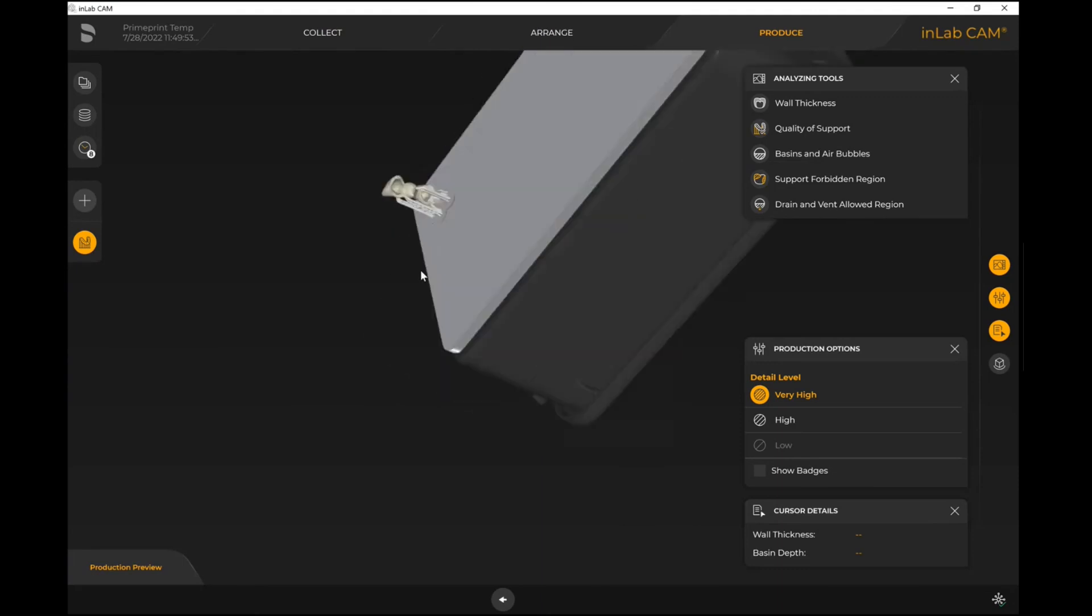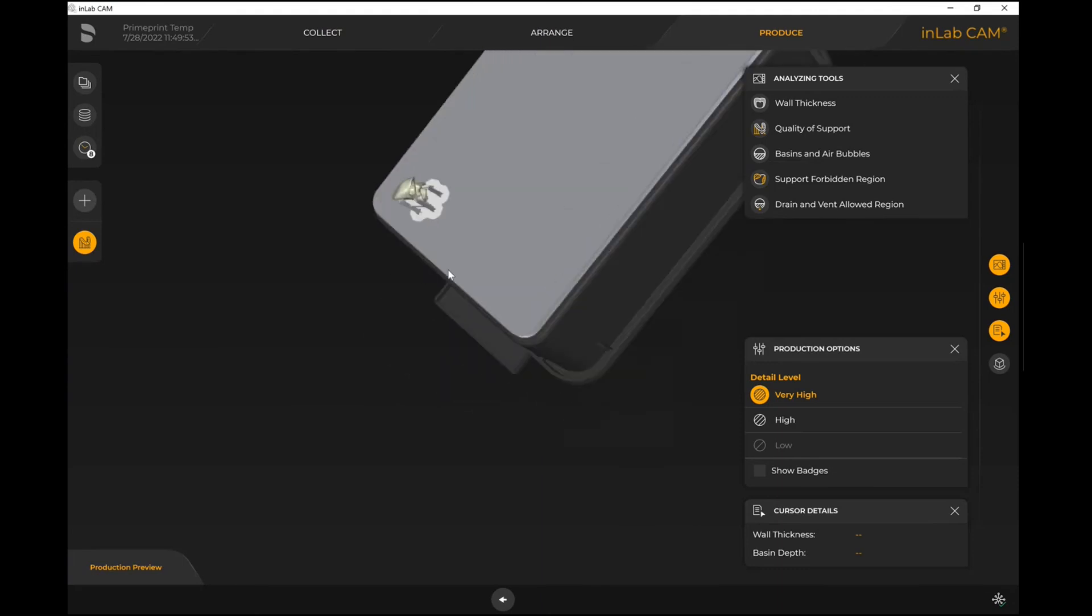If I was actually connected to a printer here, I'd be able to proceed forward with preparing the actual cartridge in the material carrier, as well as proceeding with production. So this has been the workflow for how to import an STL file or other file types to the inLab CAM in preparation for manufacturing. Thank you so much for joining and stay tuned for more videos.